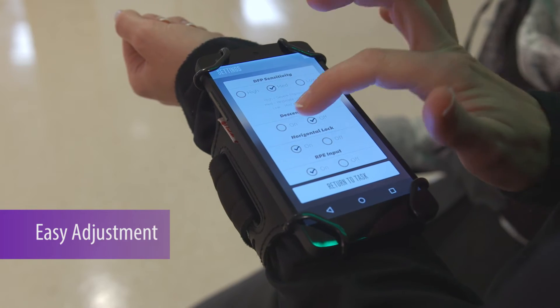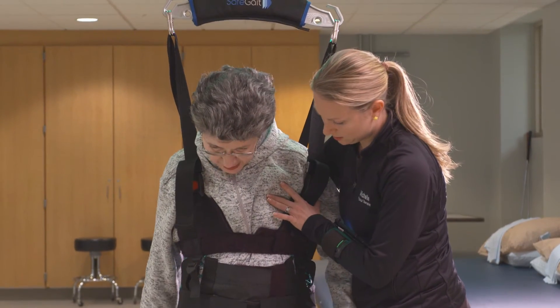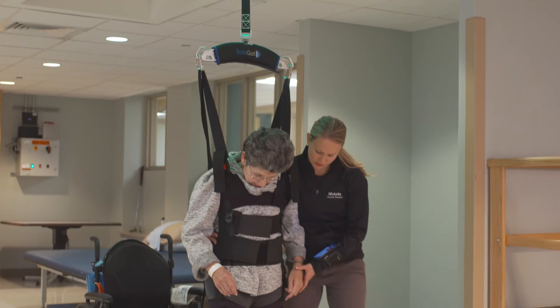Unlike traditional rehab programs, SafeGate enables therapists to safely perform one-on-one assessments and interventions, increasing efficiency and productivity.